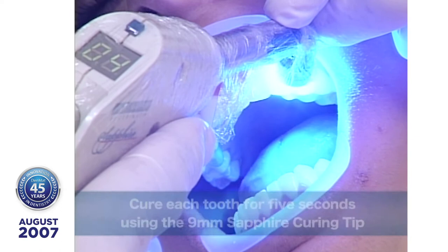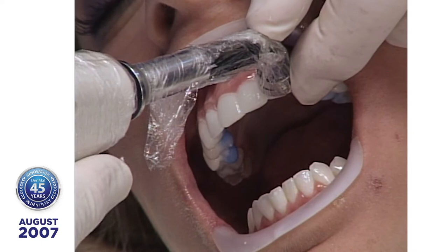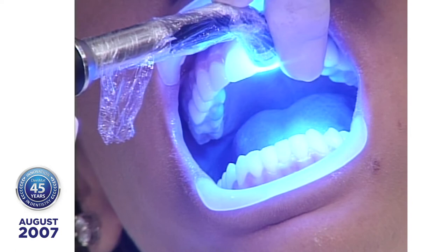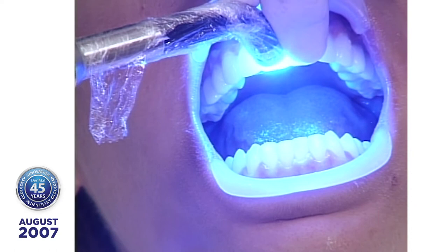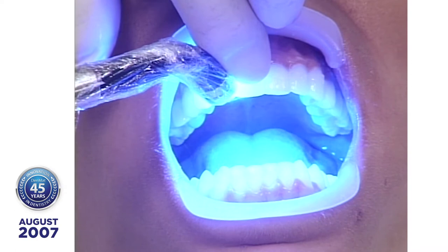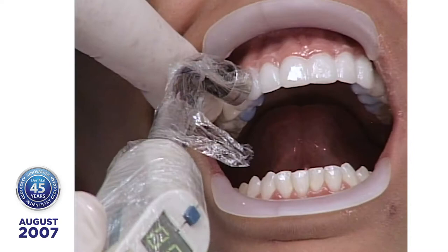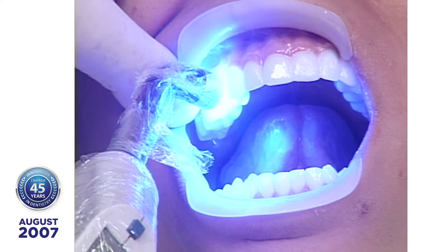I'm not trying to be fast — today I'm not wasting any time. What I'm attempting to accomplish is to show you how you could be doing this back in your practice. It's all about getting ready and then doing it, knowing what you're doing. I always have a lot of reservation about bonding to somebody who already starts out with attractive teeth — what have you got to win? But I've always seen them coming back looking better.